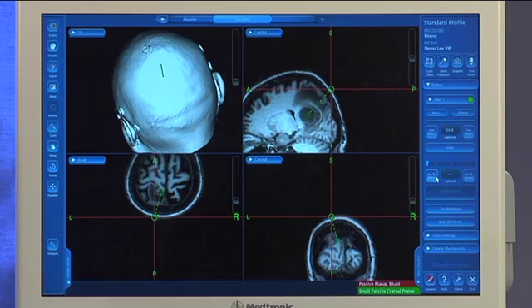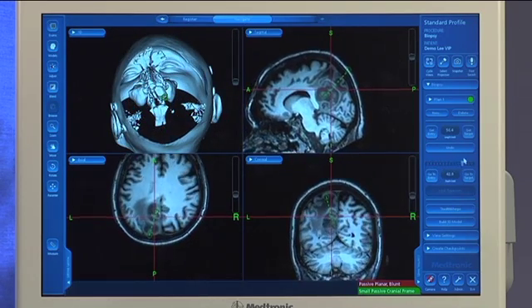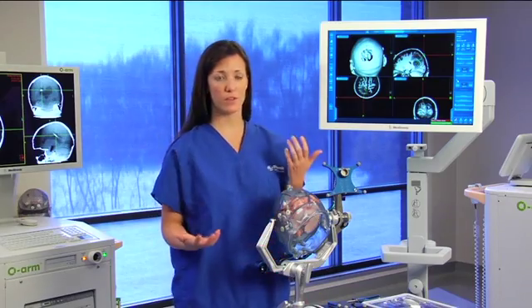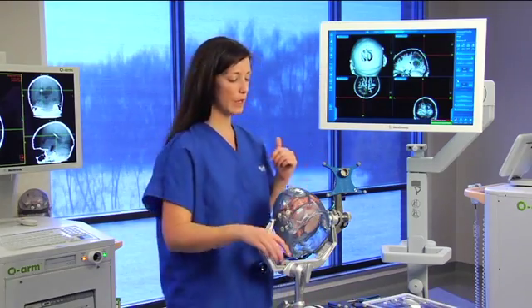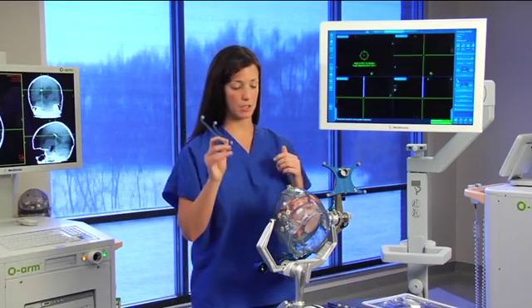Now what I can do is hit go to entry, and I can actually scroll through my plan to see the anatomy that I'm going to be going through. Once I'm happy with that surgical plan, the next step is to come in and bring in the Navigus probe.